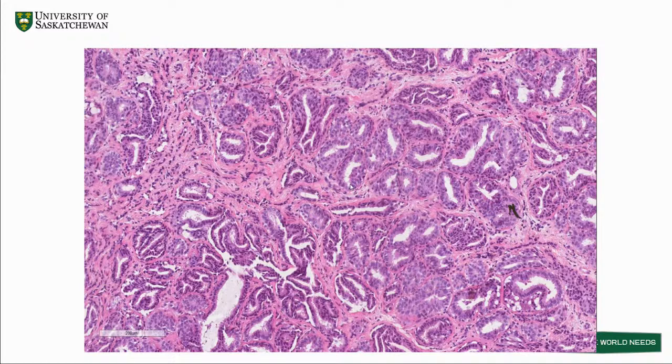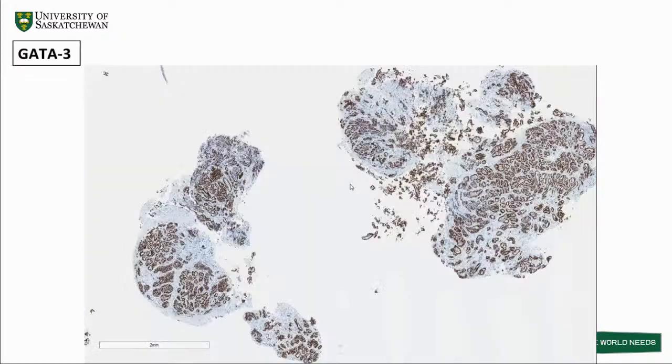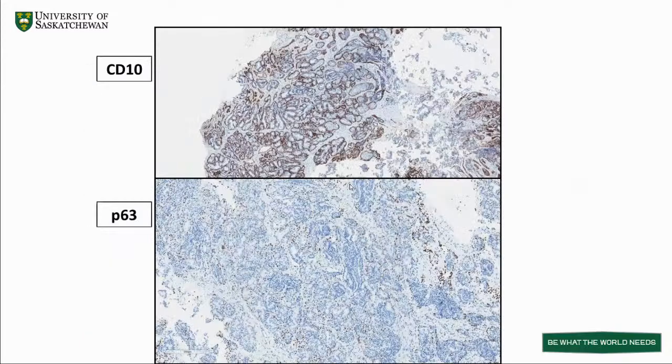And what ended up happening with this one is that there was a multitude of immunohistochemistry done on it. And this is also a cautionary tale of doing immunohistochemistry and knowing what it is that can be positive with the stain that you're using, and that it can be positive for more than what you're thinking. So GATA3 was positive. But it wasn't done on the first round. The GATA3 was done on review. So I don't think it was picked up on the first round, but as you can see, it's positive for GATA3, a breast marker. There were lots of other things that were done on the first round.